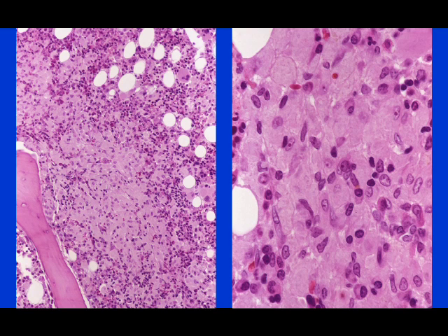Now, not all that looks like Gaucher's in the bone marrow biopsy is, and this is a striking example. I think these lesions look very much like the lesions that we saw in our first Gaucher patient. This patient presented, once again, a young man in his 30s with no particular history except he had cytopenias and had splenomegaly.